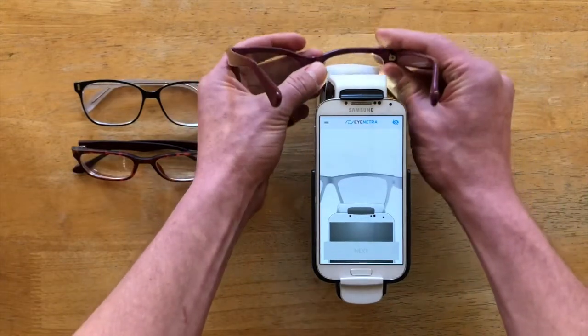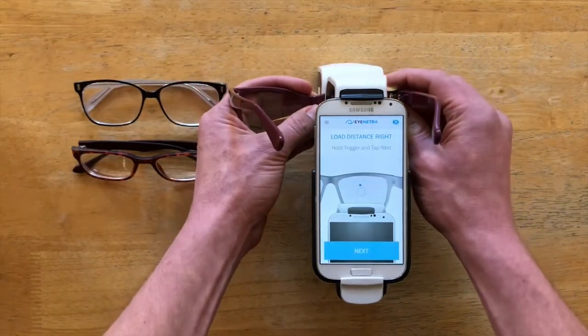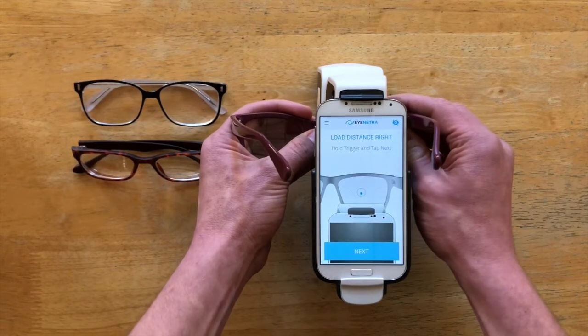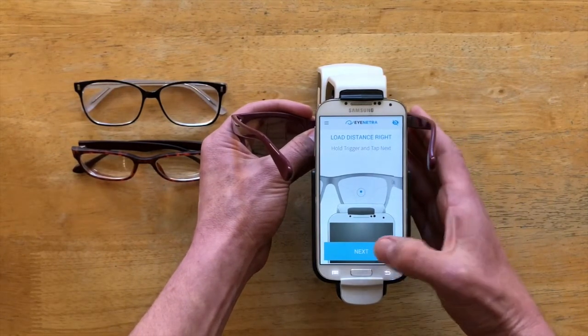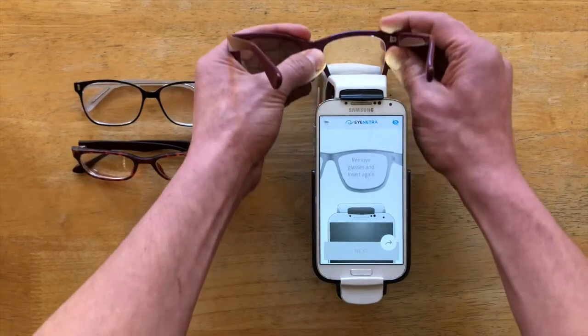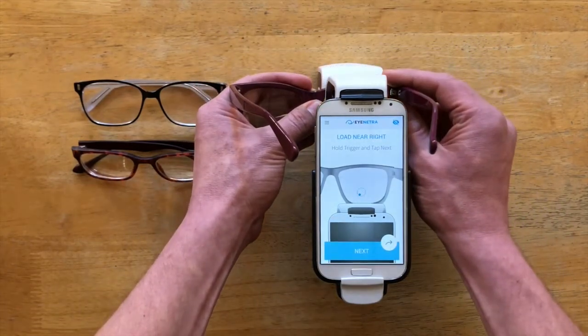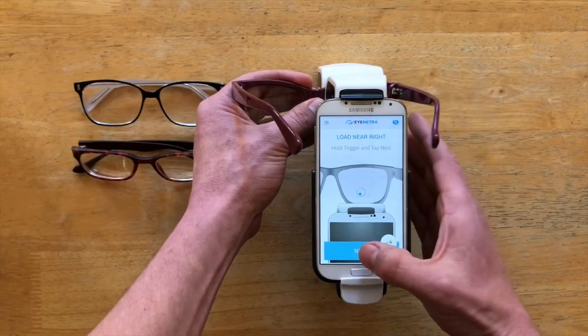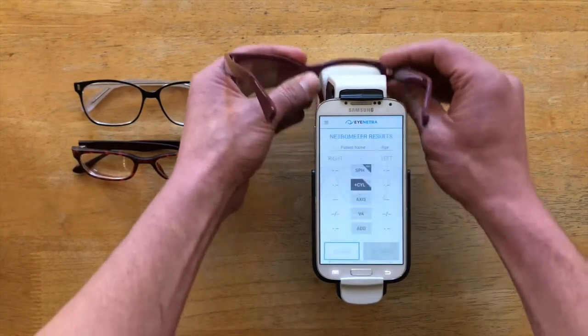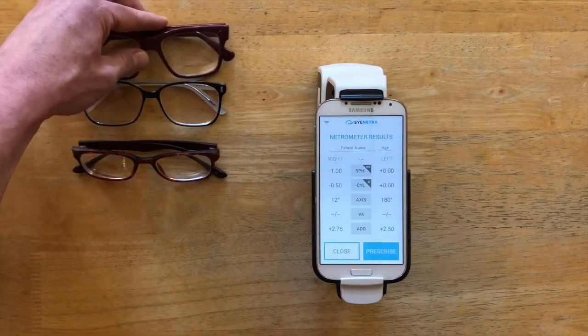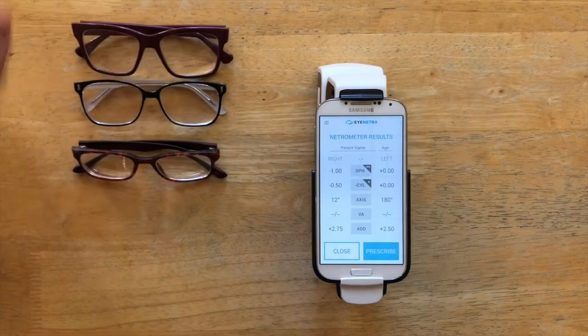And you'll notice I'm always using nice, slow, controlled movements when I'm taking my measurements. Again, find the distance measurement, remove the glasses, and reinsert them slowly. Very good. And there we are.